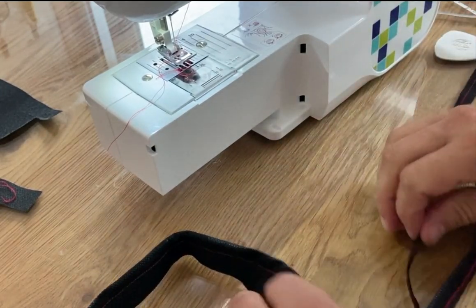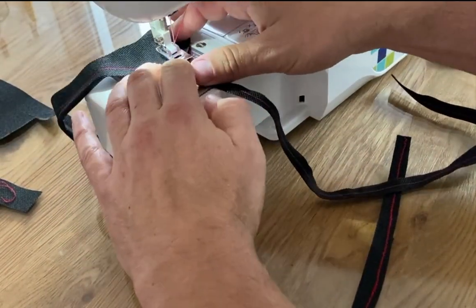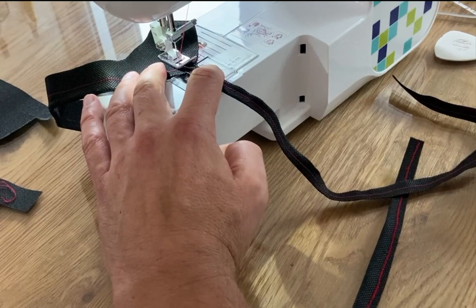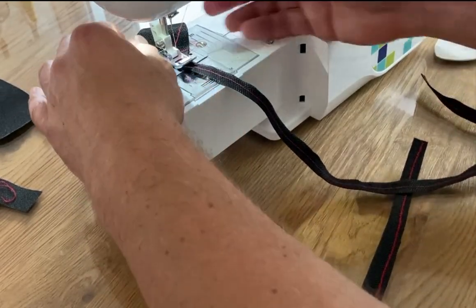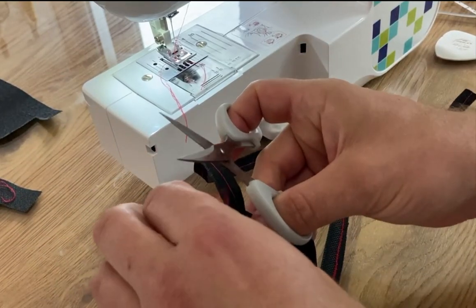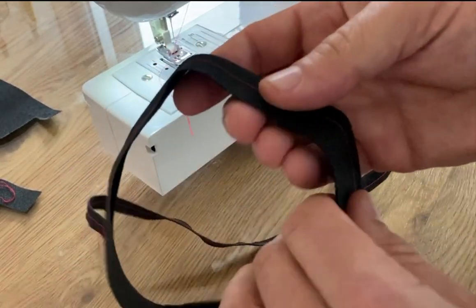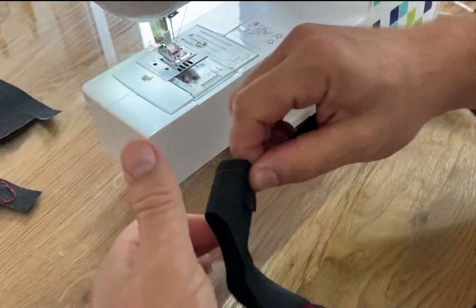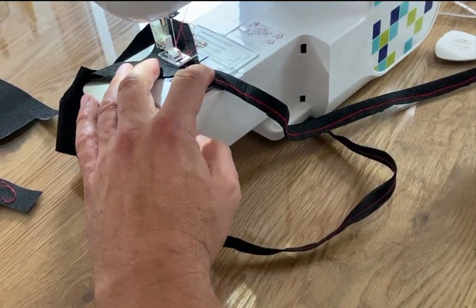Finishing it, at least in this incarnation, is some straps that are going to tie in a bow behind your head. This stuff is slightly stretchy, it kind of helps as you're putting it on, you lower your chin to your chest and you tie the bow behind your head, under your ears, just a high neck mark. And then, you know, practice plenty of times, but most adults will be able to tie a bow behind the back of the head. Stays on for ages, doesn't need adjustment.